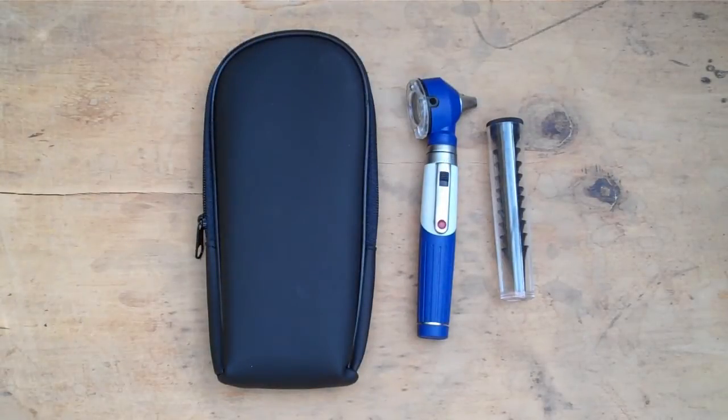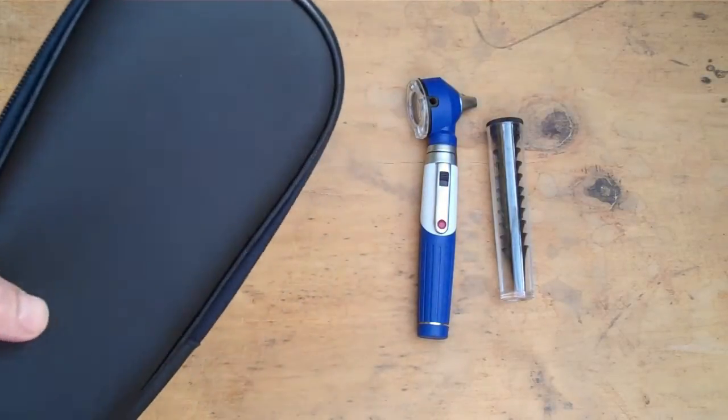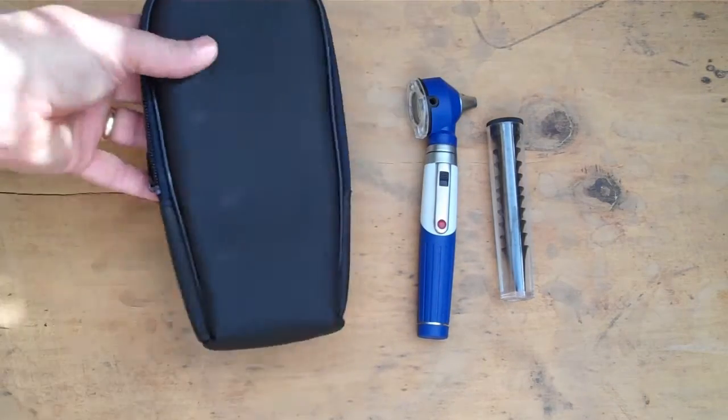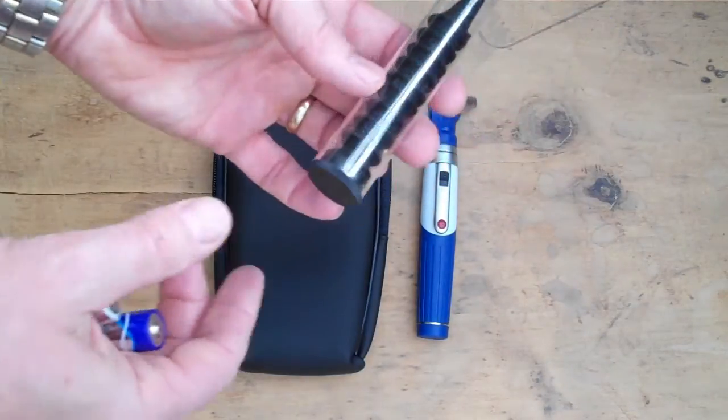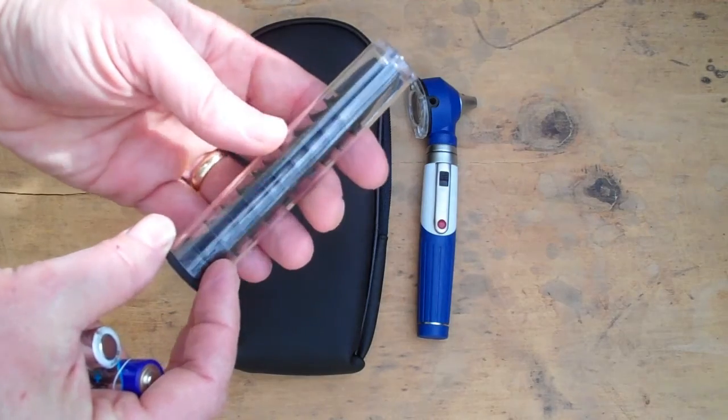This is a video presentation of the Valumed mini pocket medical diagnostic otoscope. When you order this online it is sent to you in a plain white carton. The actual otoscope is packed in a soft pouch with a zip and internal pocket system.